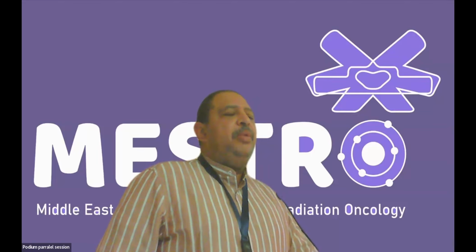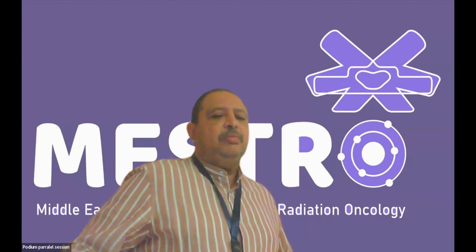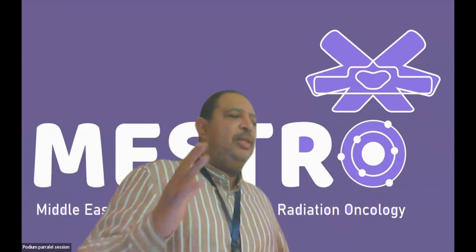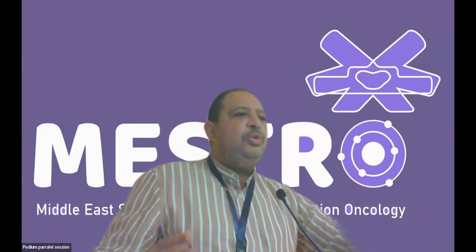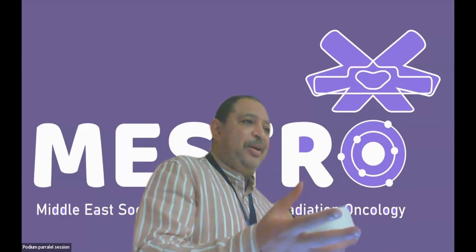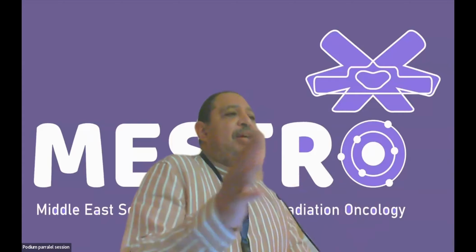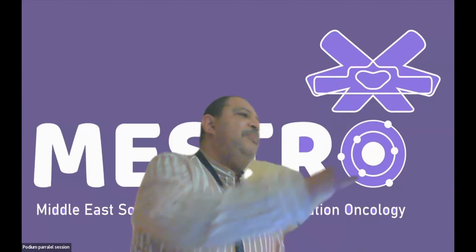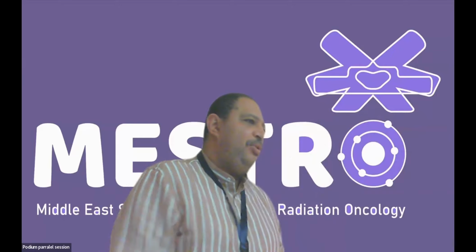And by the way, another question is how many images do I need? And if, for example, I manage to get a model, do you need to train it at the same time? Actually, there is something called transfer learning. So you can start with the model that has been achieved and then modify it, adjust it based on your machine or your data.